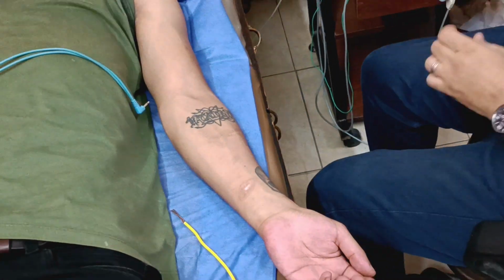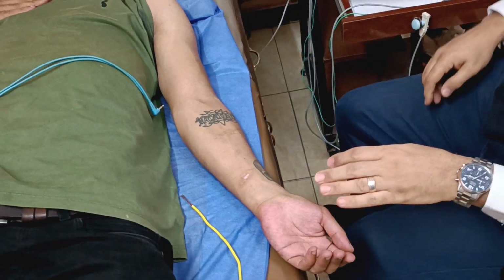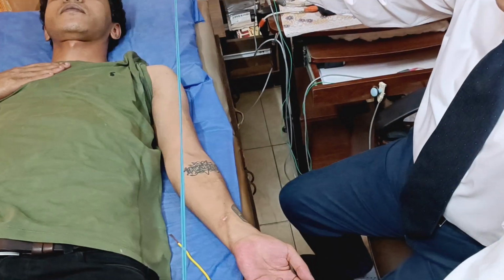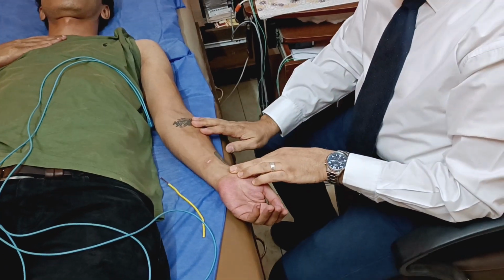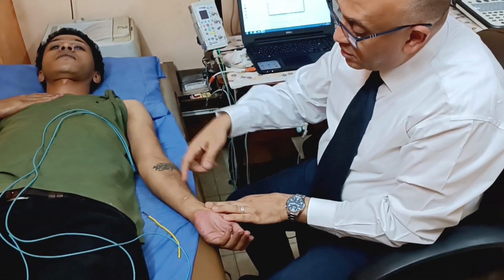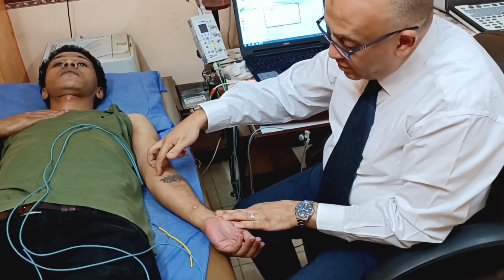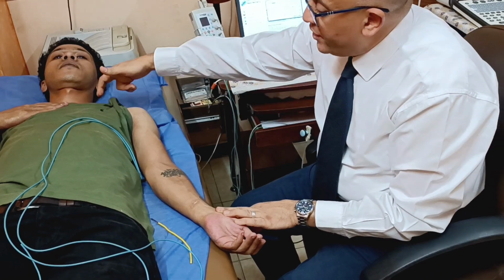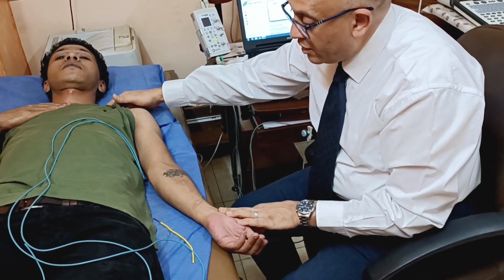So the main rule when doing a conduction study for the median nerve, which is a long nerve, is that, as Robin Devon said, you must get distal stimulation at the wrist, proximal stimulation at the elbow, mid-arm stimulation like here, and then Erb's point stimulation like here.